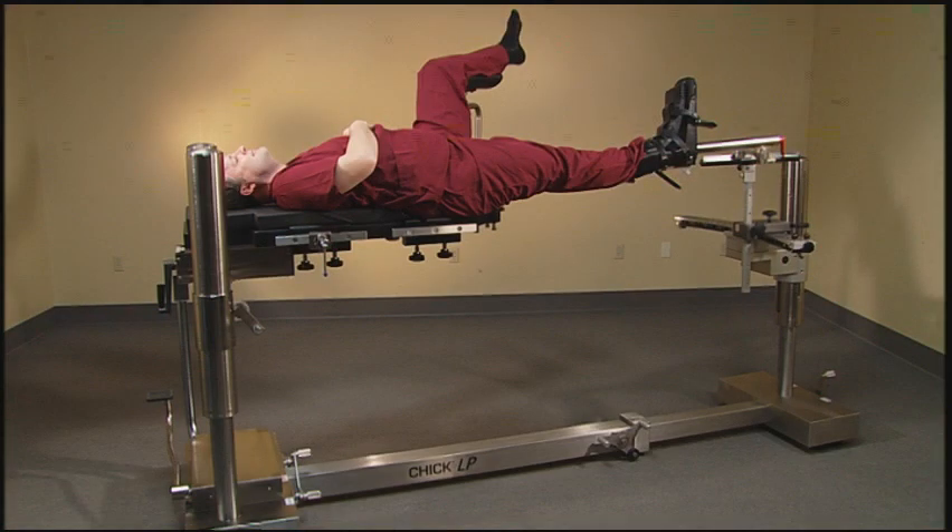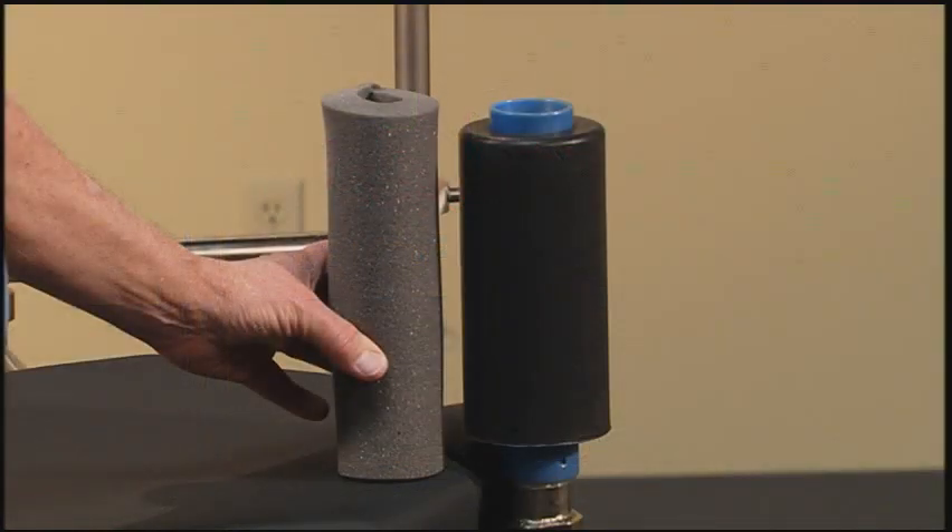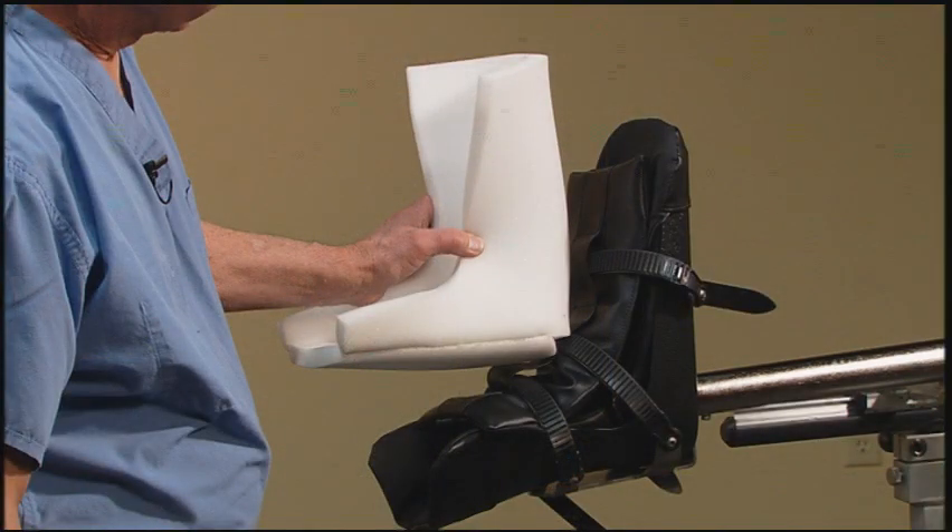During the surgical procedure, the surgeon can raise the table to a height of 54 inches to allow access to the hip or to the femur. Disposable perineal post pads and disposable boot inserts are also available.